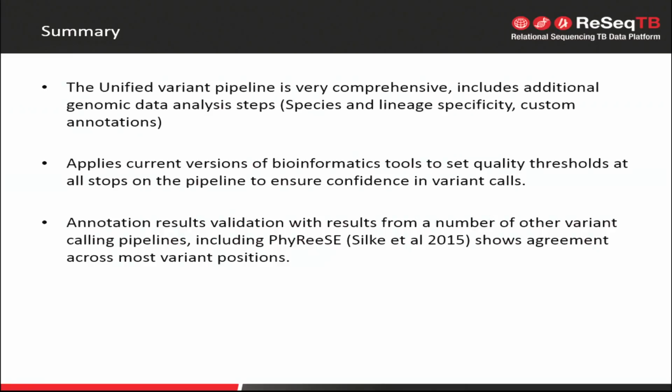We will have that probably towards the end of the week when we have the ReeSeq TB face-to-face meeting. We have about 10 questions we need to make sure we are all in consensus on. I do not want to have to reanalyze all this data again. And when we lock those in, we can move forward with the next set of isolates that will be feeding in there. And like I said, all this has been validated too. We did a direct comparison to PhyResSE and to some Sanger sequencing to actually validate this pipeline.